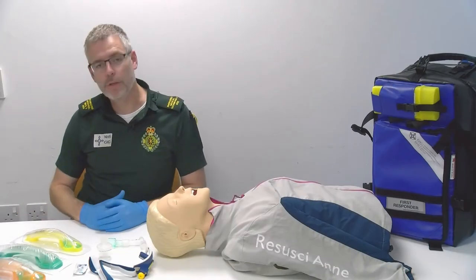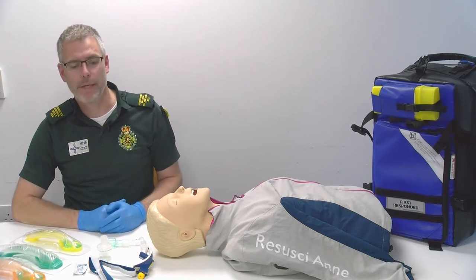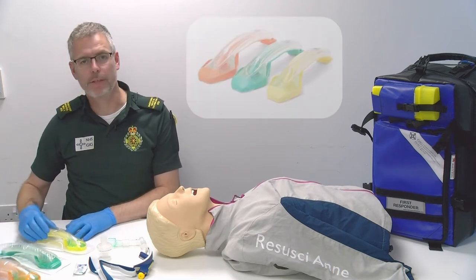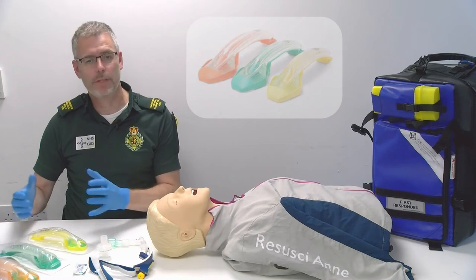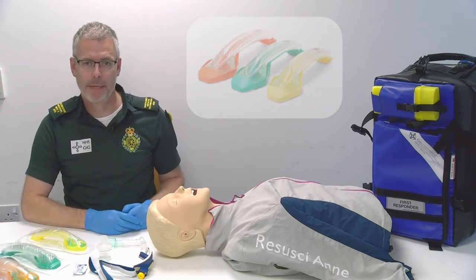We're going to be talking about iGel insertion and for that we need this kit on the table in front of me. For adult iGel insertion we have a size 3, a size 4 and a size 5 with weight ranges indicated on each size. You would select the appropriate size iGel for the size of your patient.